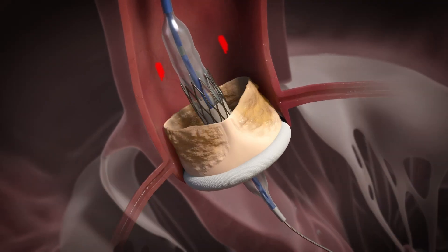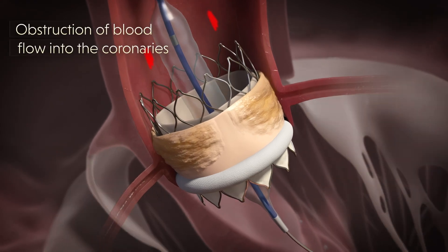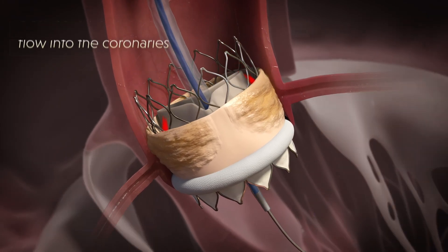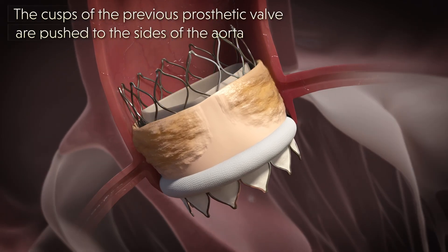Implantation of a replacement prosthetic valve inside an old degenerative one can lead to obstruction of blood flow into the coronaries, when the cusps of the previous prosthetic valve are pushed to the sides of the aorta by the new implant.